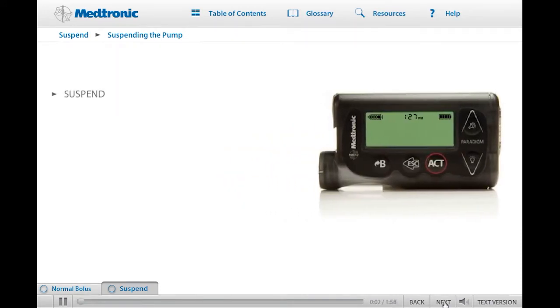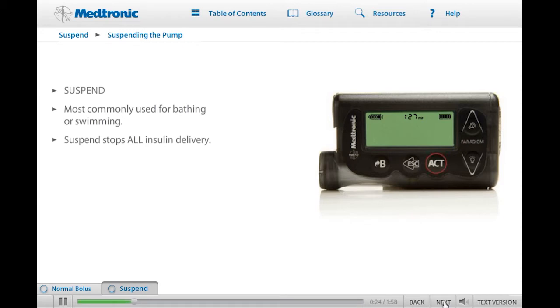The Suspend feature allows you to stop the delivery of insulin on your pump. Suspend is most commonly used when you want to disconnect from your pump for bathing, swimming, or some other activity. When the pump is placed in Suspend, all insulin delivery — both basal and bolus — is stopped. We'll go through how to suspend and resume insulin delivery on your pump now.